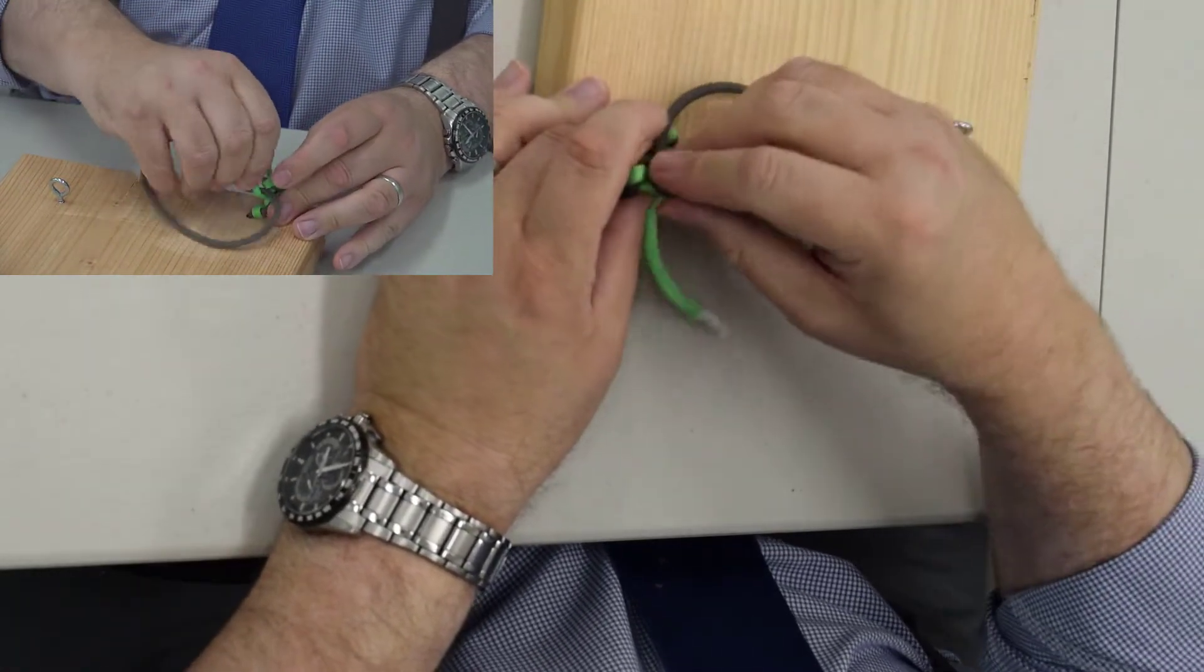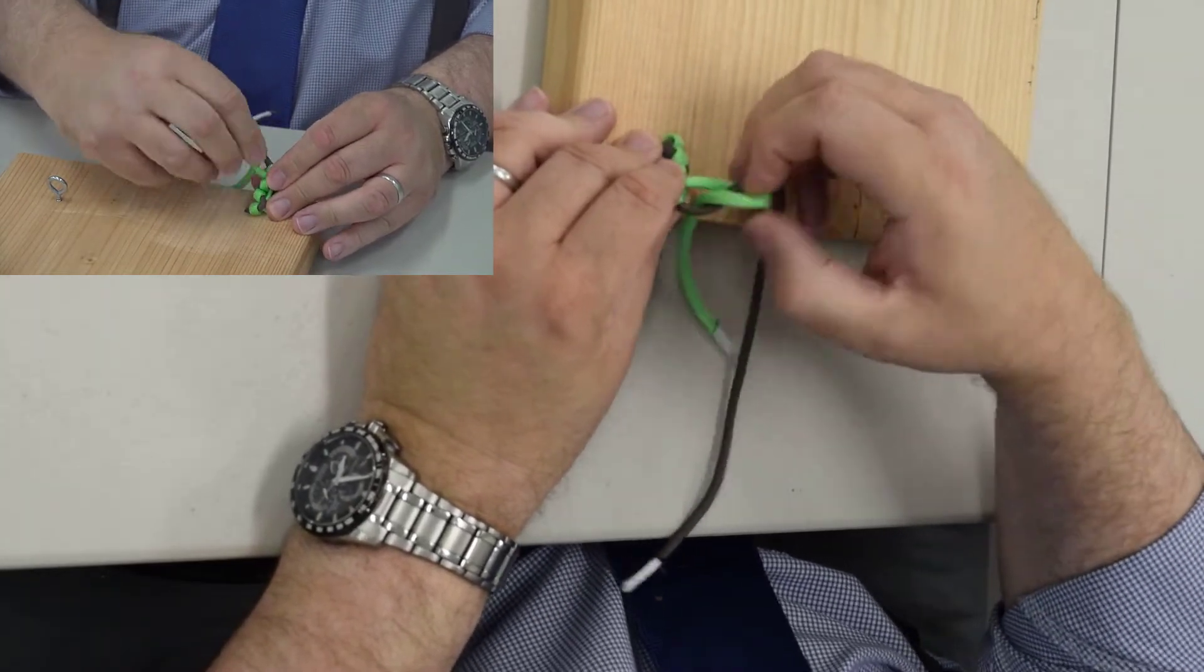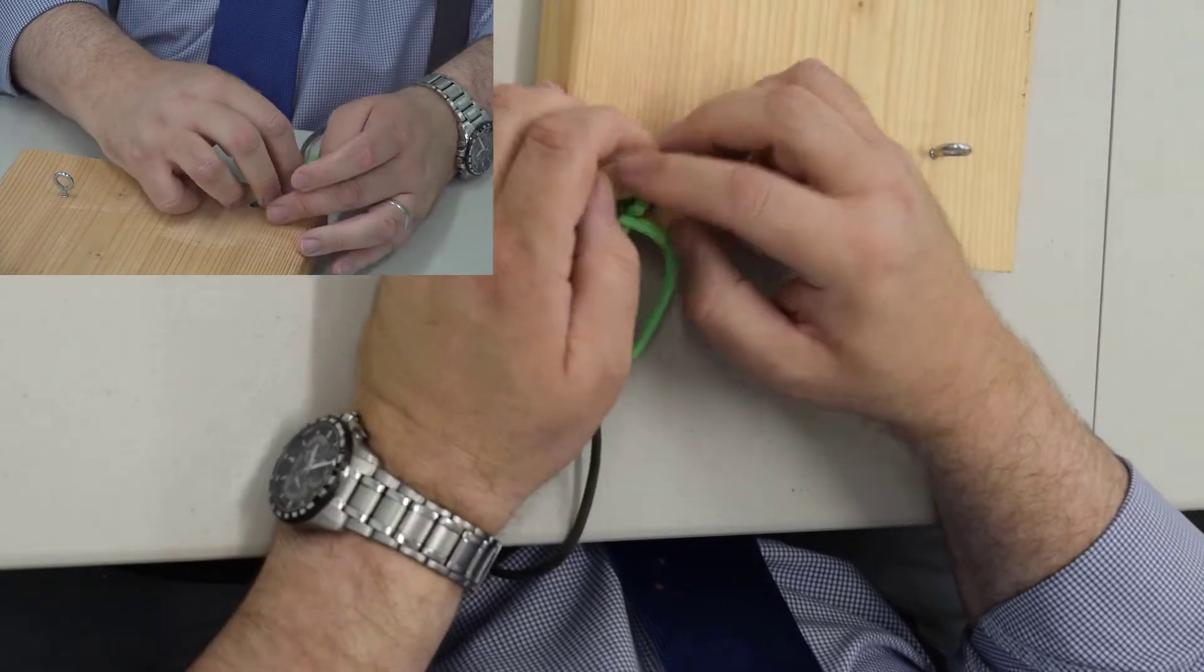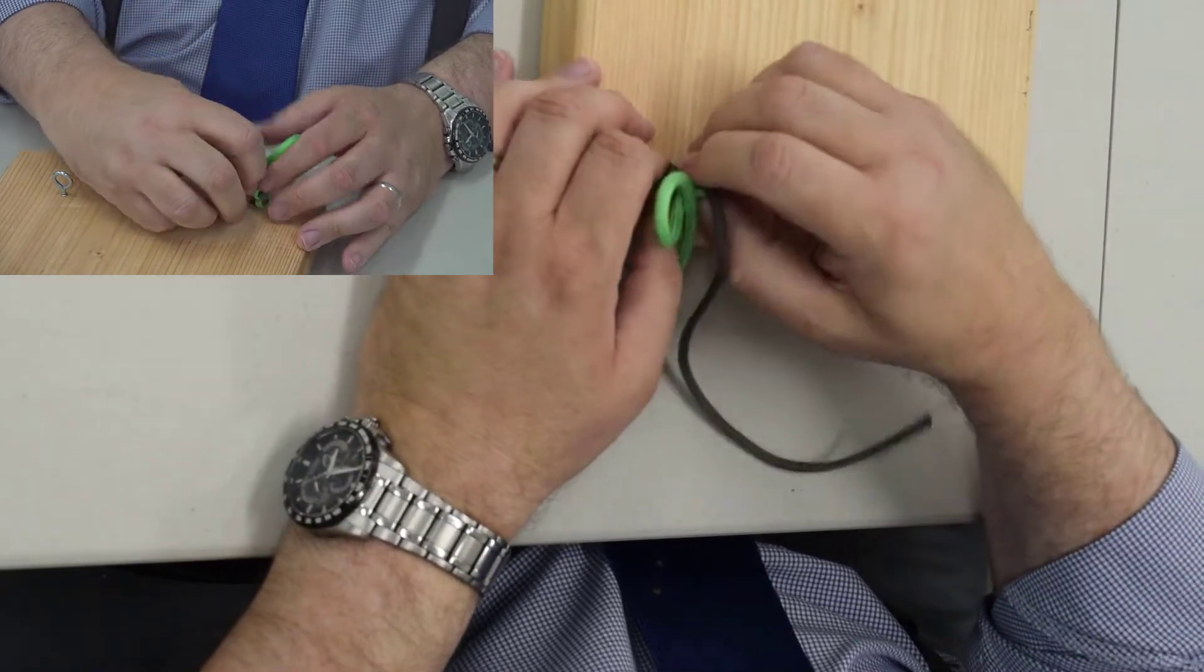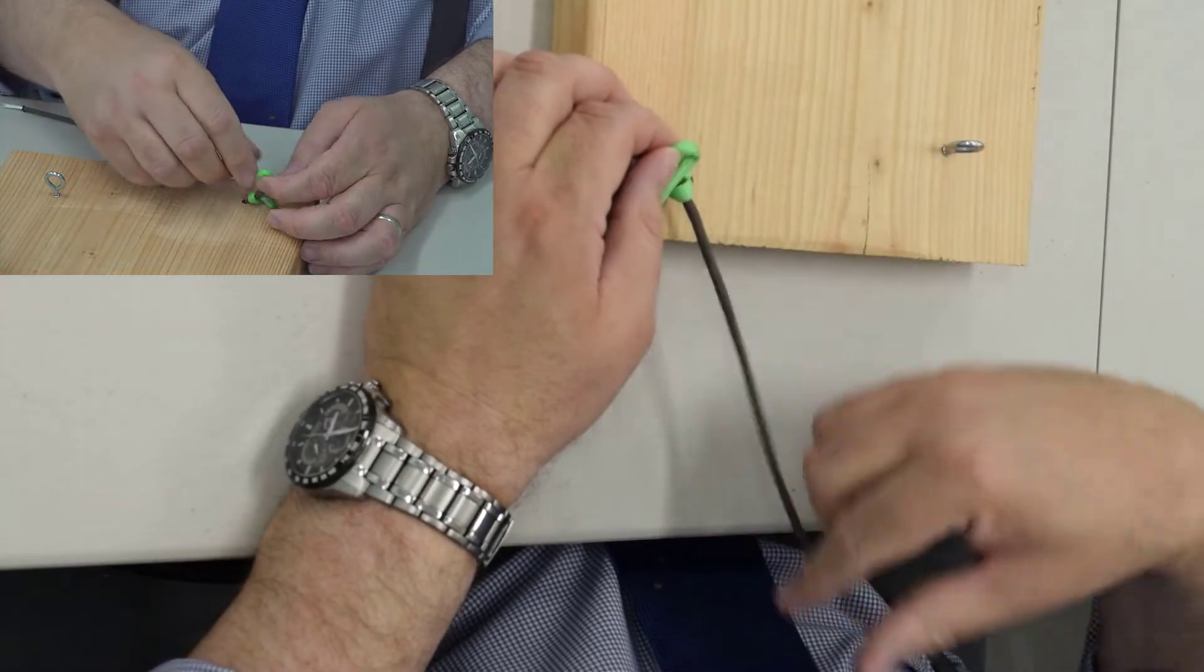Two-handed tie is better to use in almost all circumstances, because it's a safety stitch. It allows you to put tension on your initial knot so that it won't come undone.